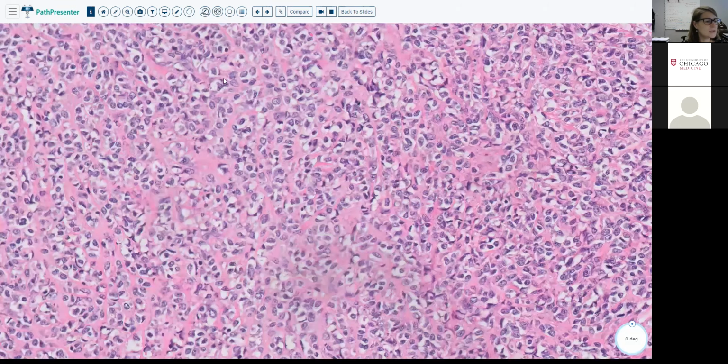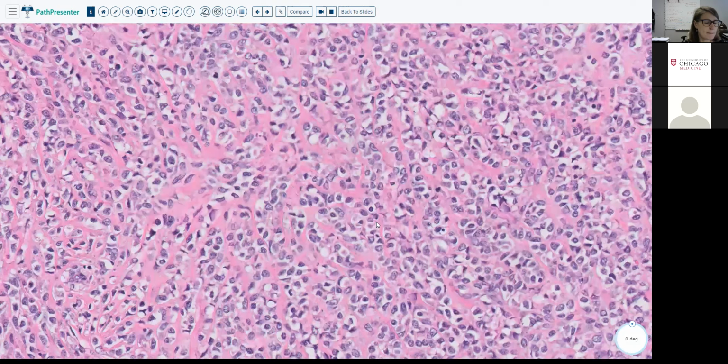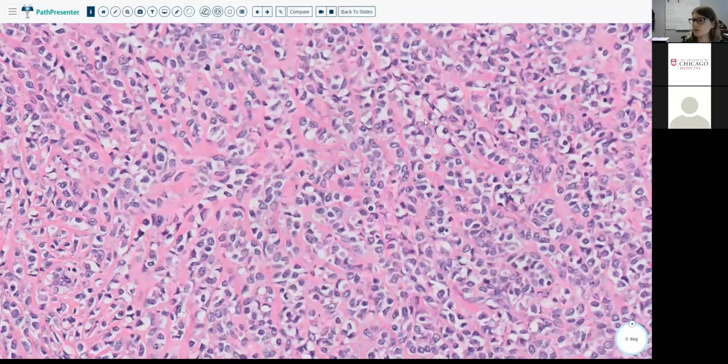So collagen versus osteoid isn't always easy to determine. Krauss uses some polarization and some occasional stains. There are theories out there that SATB2 as an immunomarker is more specific for osteoblastic differentiation in the cells producing it, but that's also been a little wishy-washy. So there's really no great differentiator between osteoid and not osteoid except morphology.